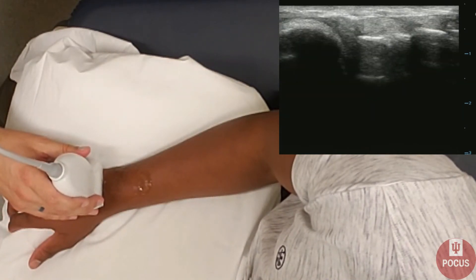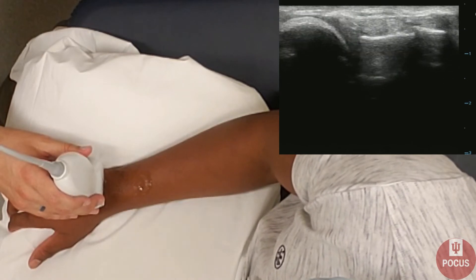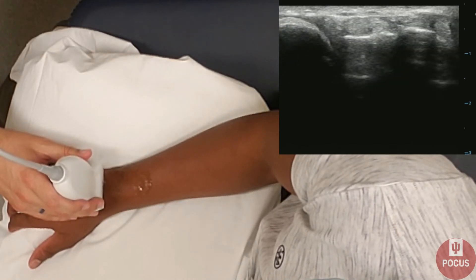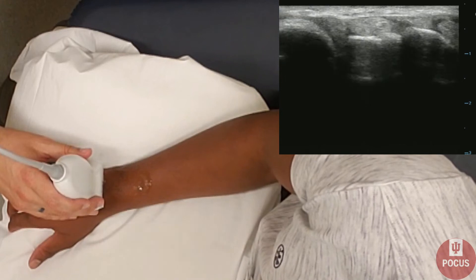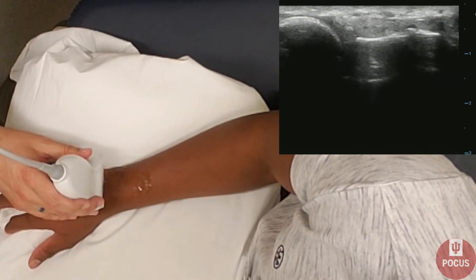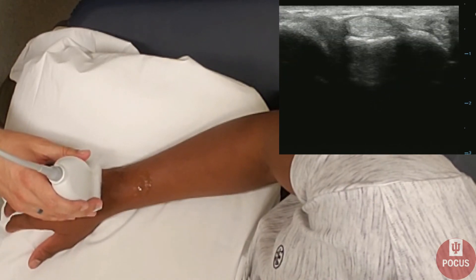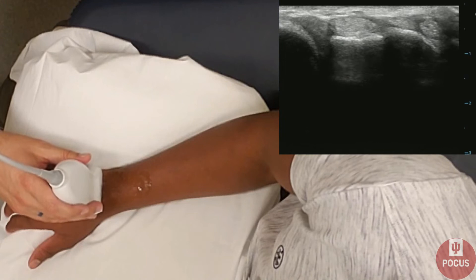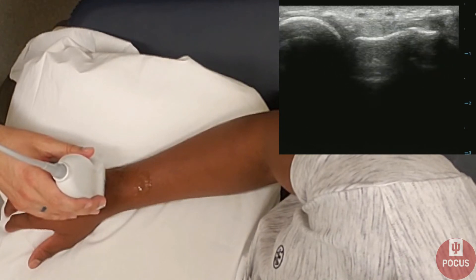Next, we can look at the extensor tendons in the hand, looking for any site of disruption in the fibrillar structure. As he wiggles his fingers, you can see the tendons moving back and forth.